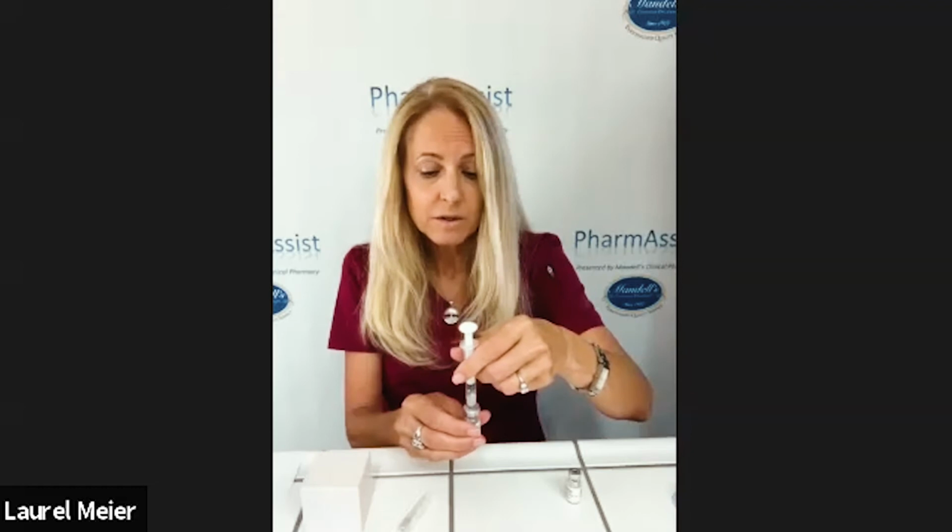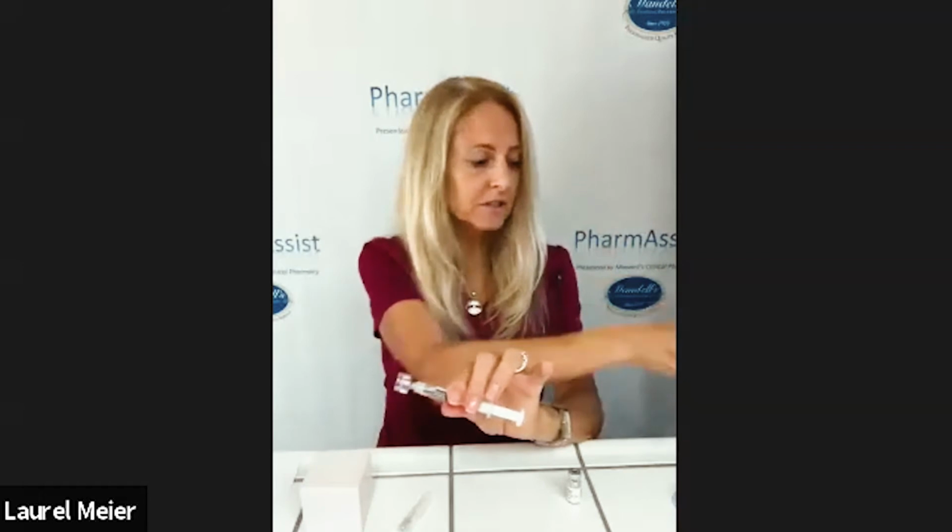Now, if you have a second powder that you need to dissolve, you're going to push the air in while it's inverted, pull everything back into the syringe, take the empty vial off, put it to the side, and then do the same thing with the second powder. Push it on, inject this into the powder. It will dissolve immediately. Swirl a little, turn it upside down, push, and pull all the liquid back into your syringe.